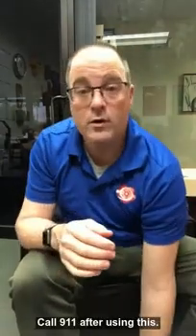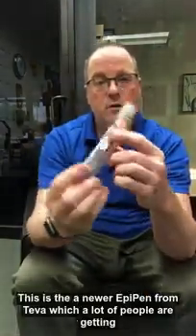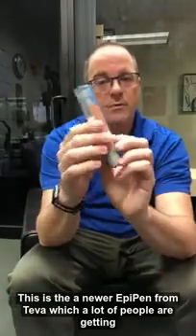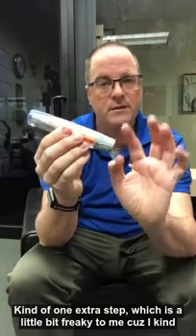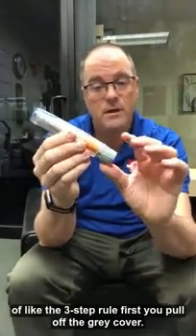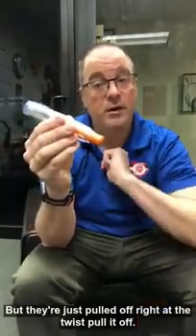So once again, it's called an Auvi-Q. Now this is a newer Epipen from Teva, which a lot of people are getting now. It's got kind of one extra step, which is a little bit freaky to me because I kind of like the 3-step rule. First, you pull off the gray cover. It's right there. You just pull it off. You might have to twist to pull it off.